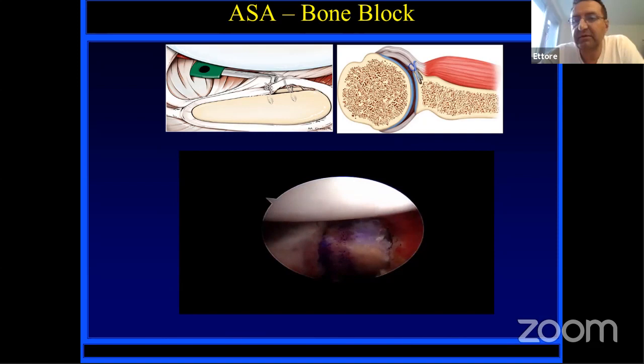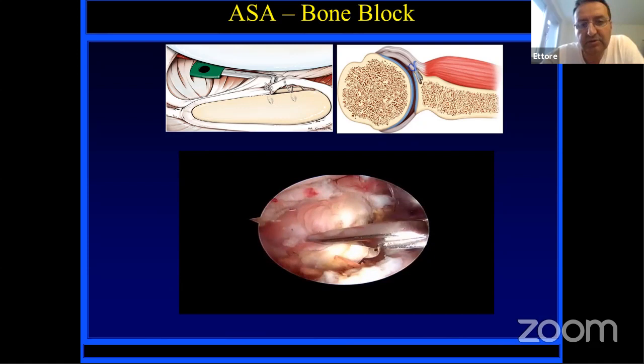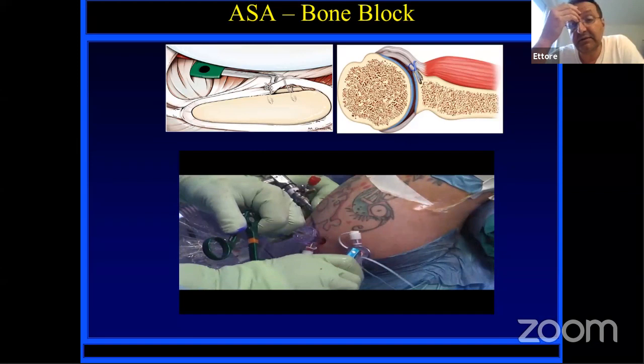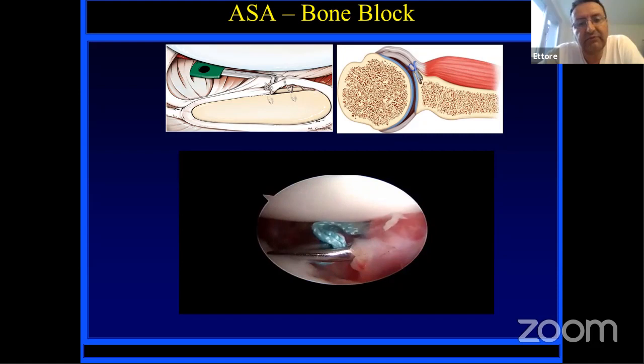And with this technique, we wanted to add the subscapularis augmentation, meaning the tenodesis of the upper part of the subscapularis. Technically, I was very skeptical regarding this because, like everybody in the past, we thought that placing the subscap in this position would highly restrict the external rotation. But then looking at his cases and Russo's cases, which have a follow-up of almost 10 years now, really there is no restriction of external rotation.